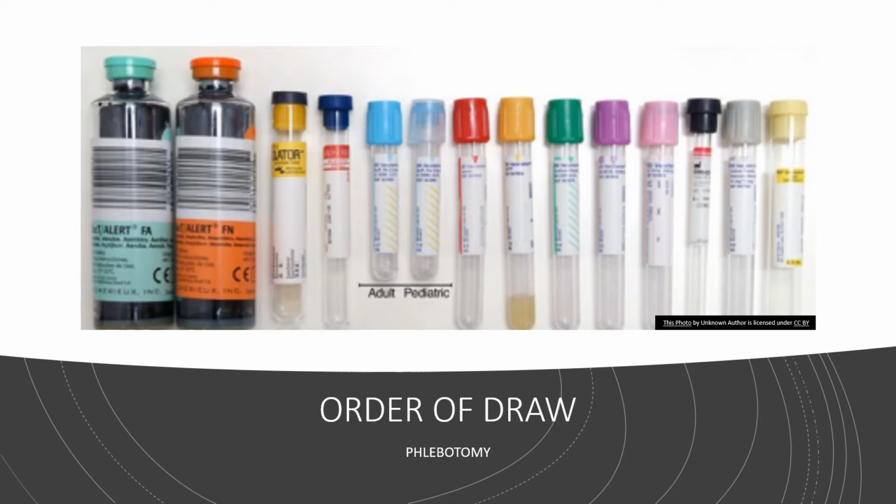And then the next tube is another yellow top tube that you can use for blood cultures. Now, honestly, you probably won't see as many of those yellow top tubes in blood cultures, depending on where you work. Typically, those bigger tubes will be the ones that you will see.